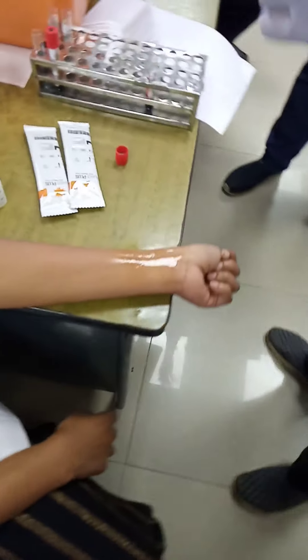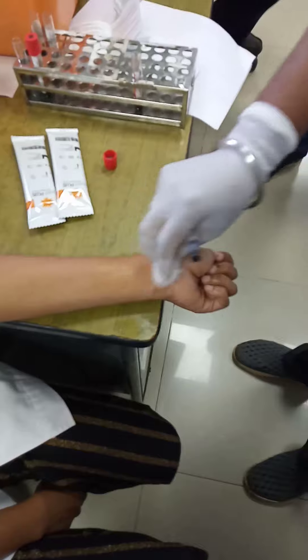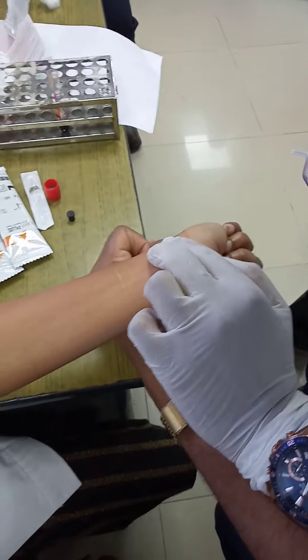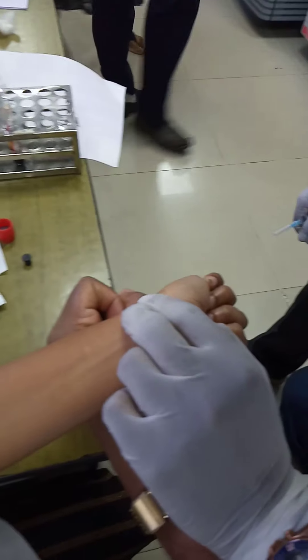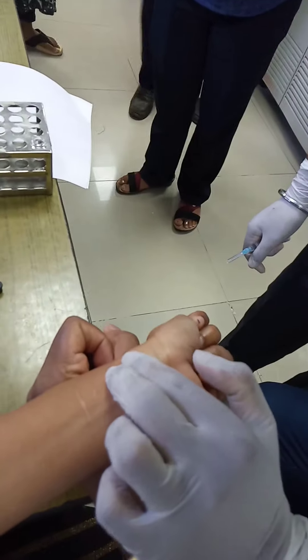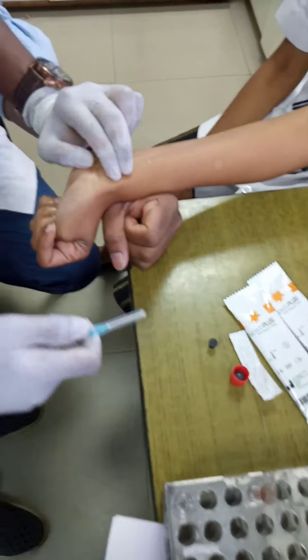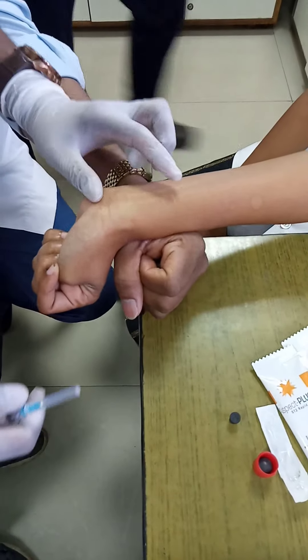Arterial blood gas collection is being demonstrated. Antiseptic has been sprayed and wiped. The pre-heparinized syringe is in hand. The hand is positioned on an elevated surface so that the radial artery can be easily palpated. Pulsations are being felt by the fingers and the cap is being removed.